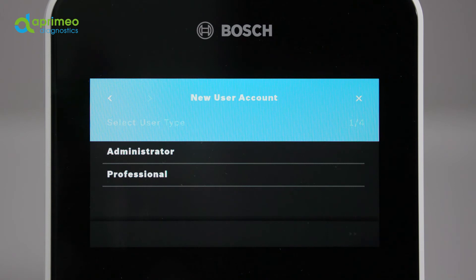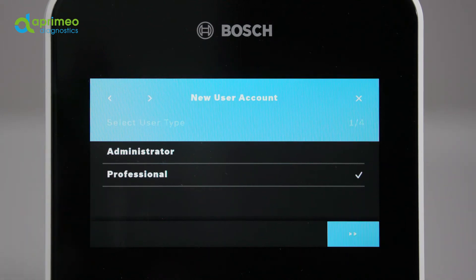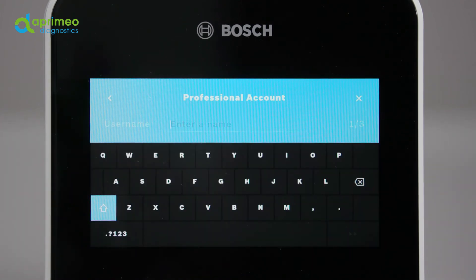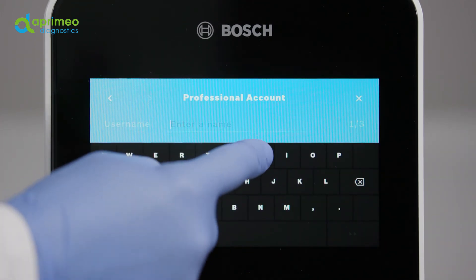Touch the plus symbol to create a new user account. To define the rights of the new user, touch Administrator or Professional, meaning a normal user. Give the user a name and define a numerical password.